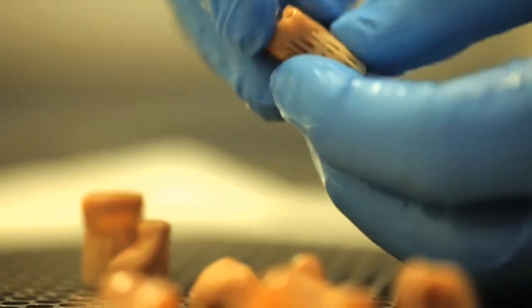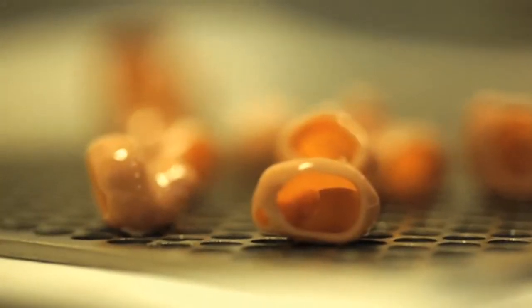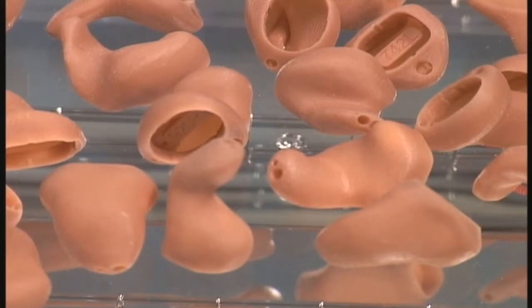Once the shells are ready, they are taken from the SLA unit and the supports are removed. These shells also have identification tags inside of them. The final step is that the shells are hardened in a UV light curing unit.